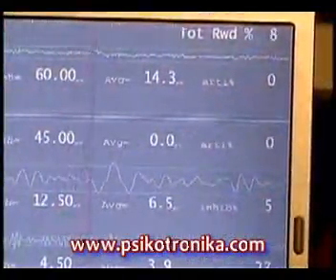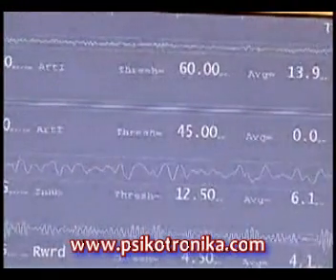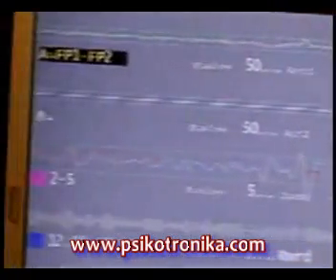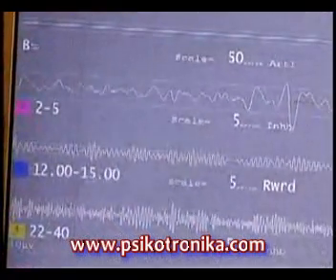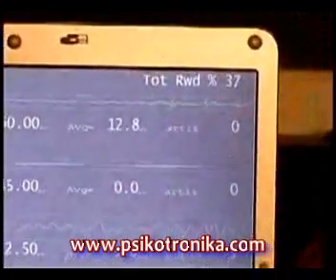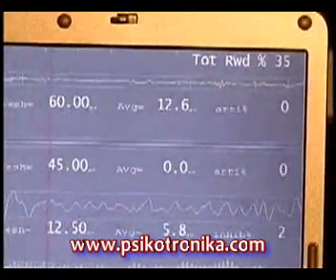I'm going back to the therapist's computer screen to show you what I would be looking at. You can see that there are no red lines in the 2 to 5 range — or very few. Then we're looking at the SMR: there's a lot of green and very little in the high beta. On the screen, I'm also looking at the total reward number. At the present time, the total reward number is 37, and 37 is excellent.